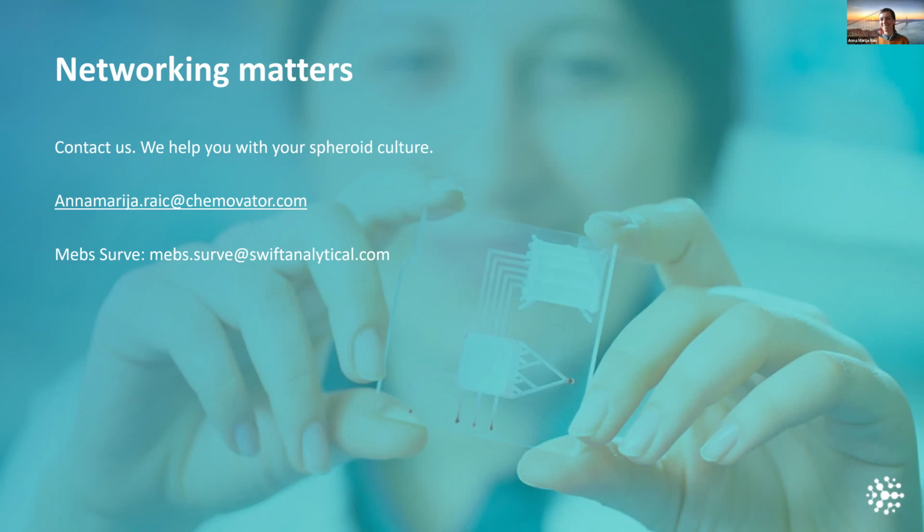Pia is asking, how does BioFloat Flex compare to Matrigel? Is it as temperature sensitive as Matrigel with regards to being in liquid or gel form? You cannot compare BioFloat Flex with Matrigel, because Matrigel is a 3D environment which can interact directly with the cells by contacts.